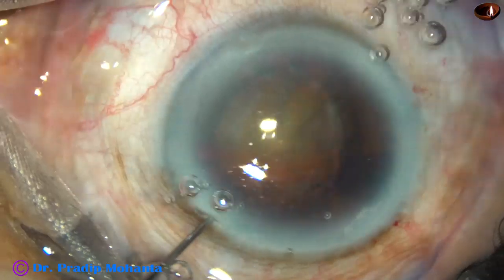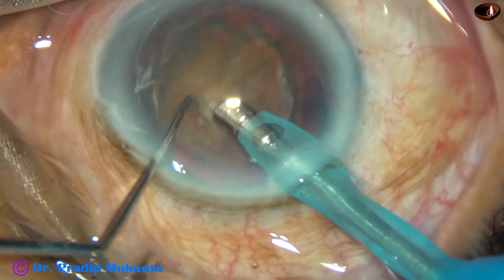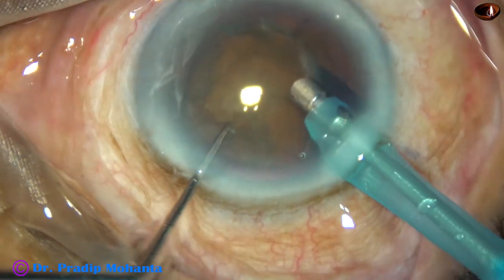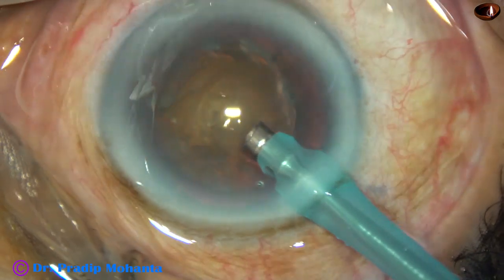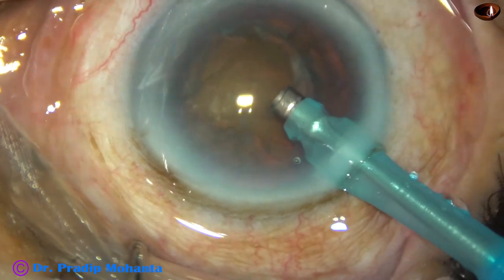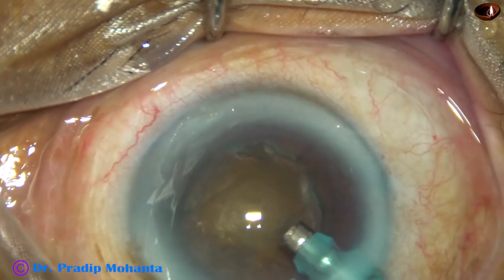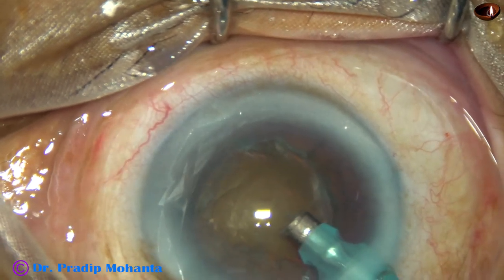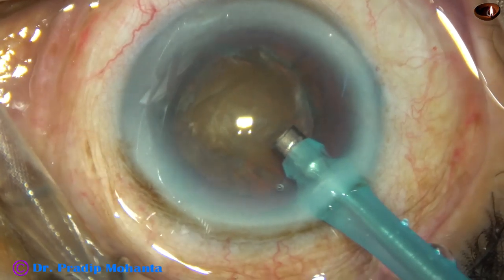This is the second case. The tip has been introduced into the anterior chamber and some superficial cortical matter is removed. And now I start sculpting. The setting is the same: 60% power, 20 flow rate, and vacuum is 60 mm of mercury.